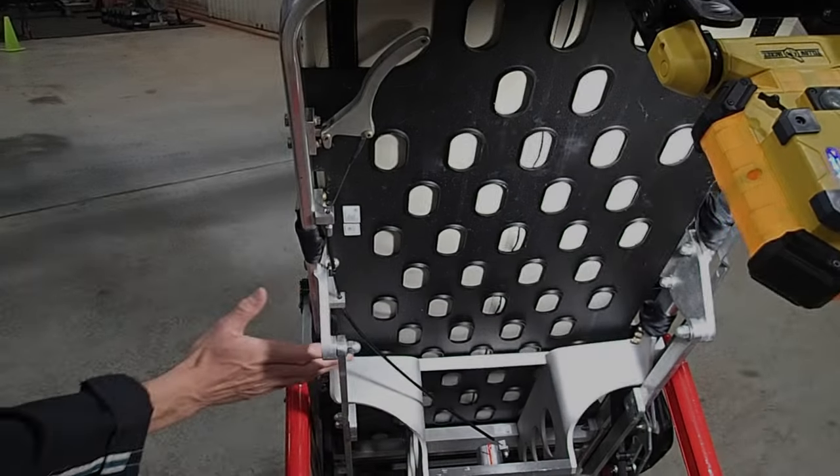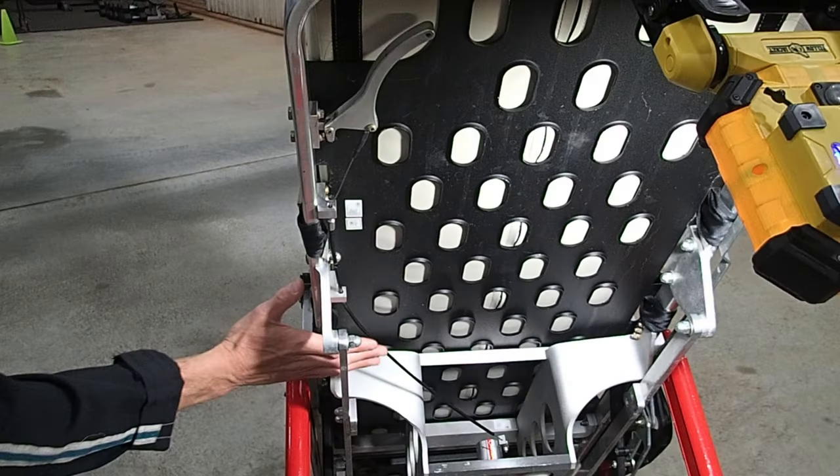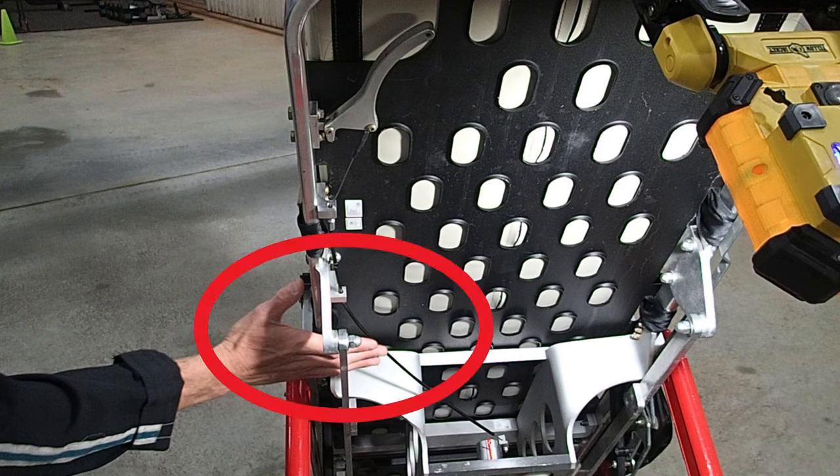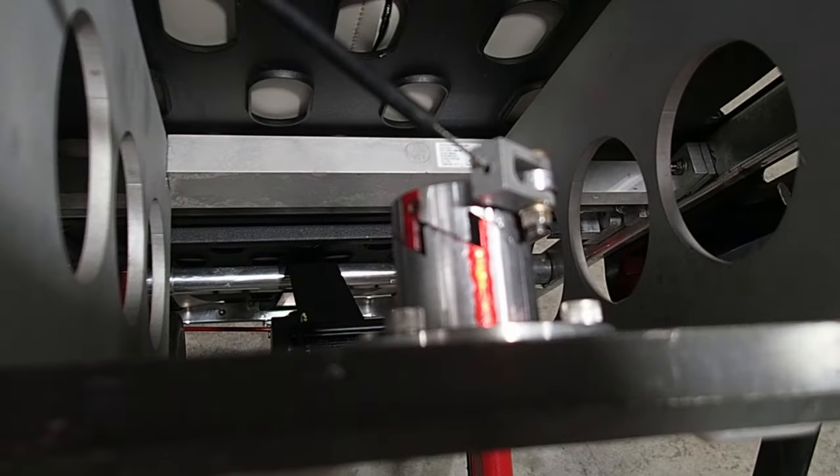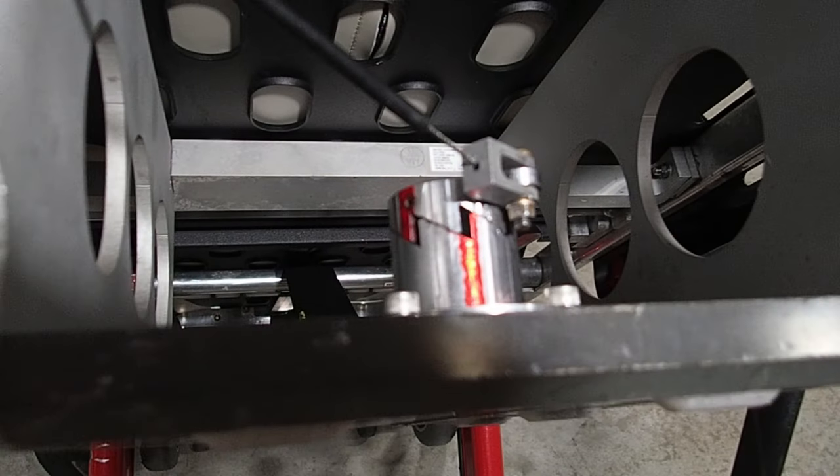Another important thing — it doesn't happen often, but when it does it can be really bad: the stretcher can get stuck in the aircraft. If you're pushing the stretcher through a field with firefighters helping, make sure they don't put their hand on the cable underneath. If they grab that cable, it releases the lock, can make the lock jump the cam, and there will be no tension on the cable to unlock it after that. I made a whole video on this — I'll put a link at the end.